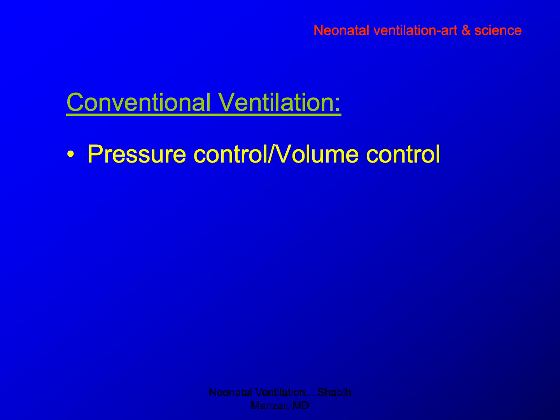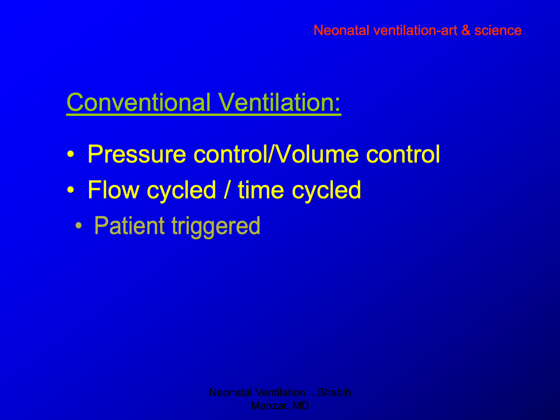If somebody is saying that the patient is on a volume ventilator, it means that the volume parameters are provided. And of course, depending upon the cycle, is it flow cycle or time cycle? As the words say, once a certain amount of flow is reached, the inspiration is halted and then the expiration starts. Same thing with time. You can do a time cycle, like 0.3 is the I time. So after 0.3, the inspiration stops and then the expiration starts.